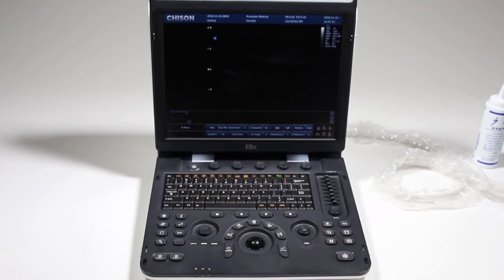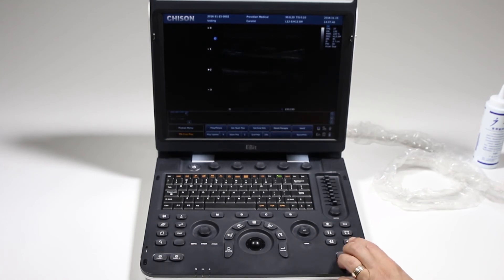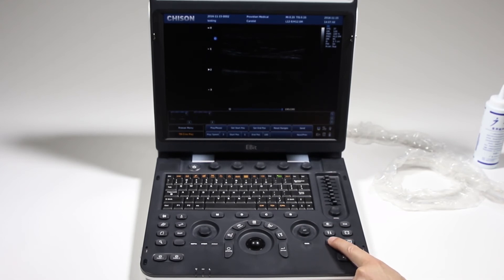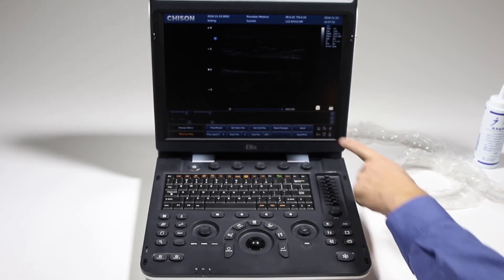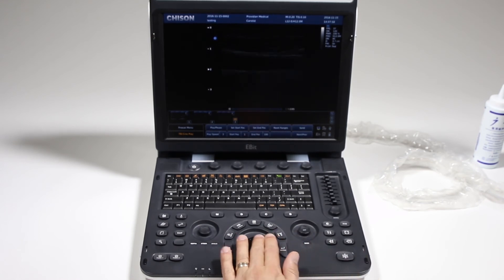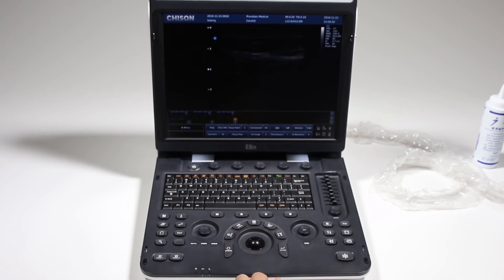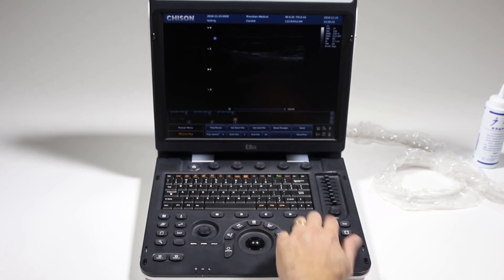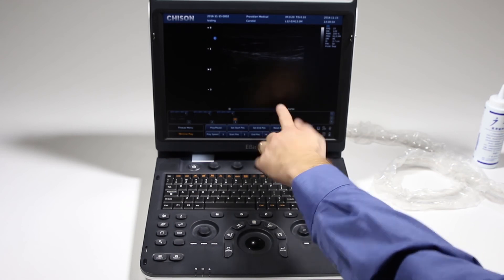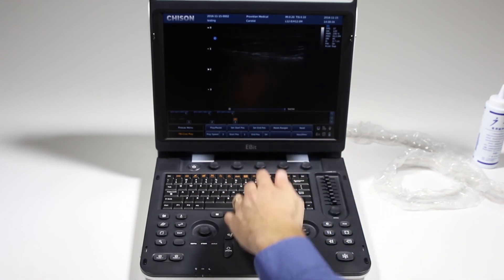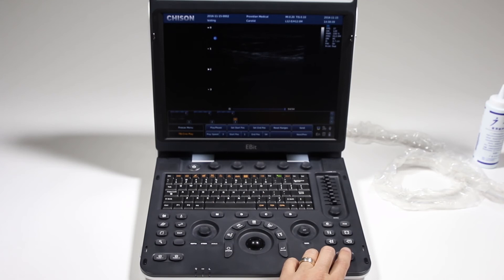To save images, there's a few ways of doing this. First you can freeze and click save here. Click this to save a cine loop. You'll see that it's writing. So that's what's called retro saving. If I have a live image and I press freeze and I click this cine loop, it's going to save the last 54 frames or however many frames I've saved.